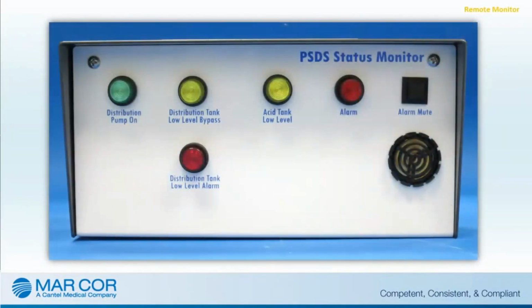The remote status monitor will notify users at a remote location of the system status and gives both visual and audible alarms. The PSDS status monitor communicates alarm conditions with the illumination of a red alarm indicator and the sounding of the audible alarm.